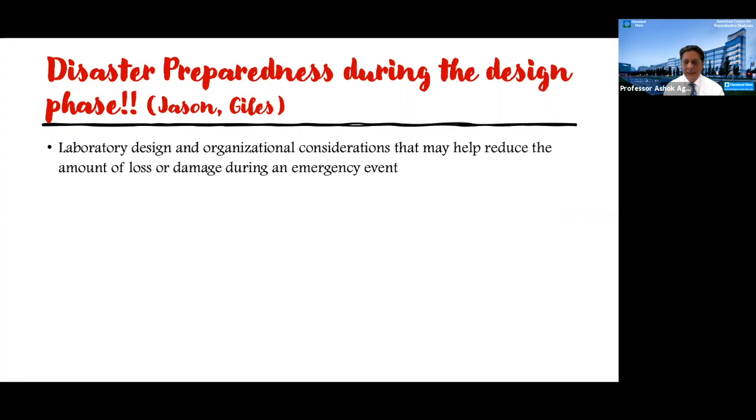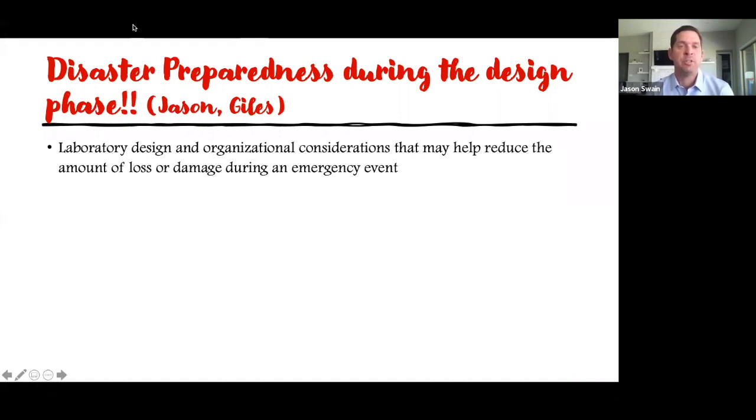Yeah, I think, for us, giving adequate time during the construction phase is important, to not rush, whether it be to prevent burn-in or just to deal with these little hiccups, whether it's a small hiccup or something big like a disaster, so that we don't start prematurely scheduling patients or making plans. And knock on wood, I've been pretty fortunate working with a team that hasn't pushed the envelope. We know it's a delicate balance between the business side and the operational side. So I think having a realistic plan and not pushing that timeline too much.